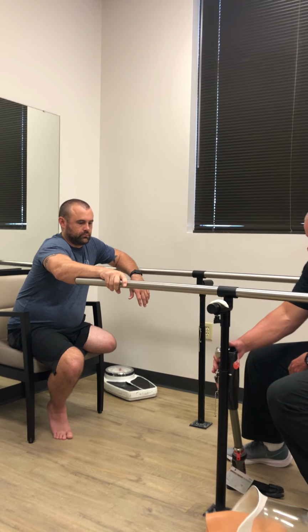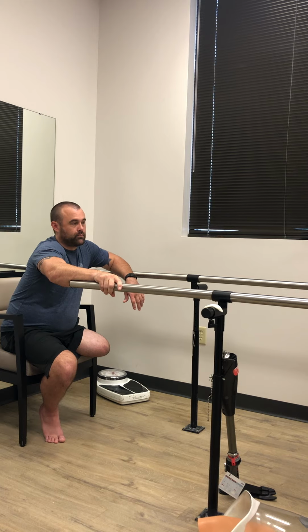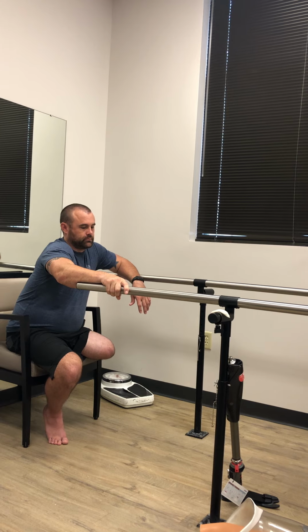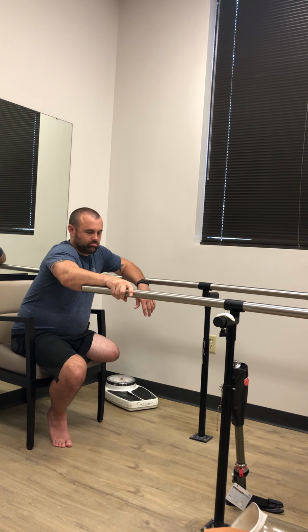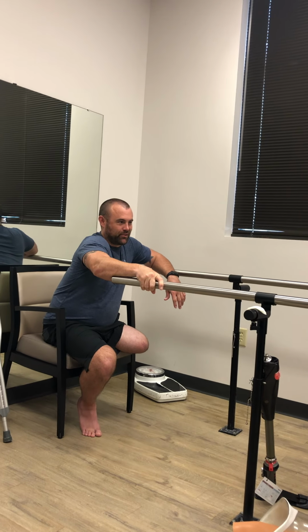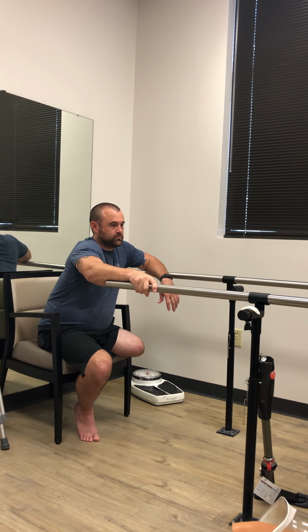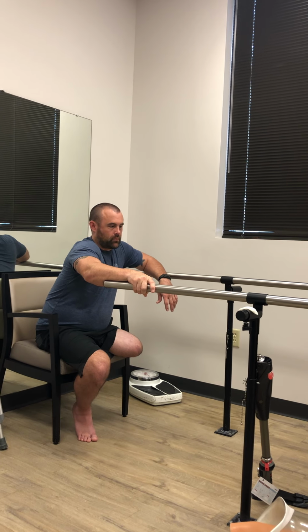So, yes, when it gets fitting badly, can you piston? Absolutely. If you lose a bunch of size and your suction's not holding good, while you're walking, you gotta remember, you're still dragging that around below you. So if your suspension's not good, can you piston? Yeah. For you, I don't think it'll be a big problem. Outside of you being aggressive, I think you'll call me, because you ask a lot of good questions. I think you'll inquire because you'll wanna know. And that for you will be a saving grace, because we'll catch it when it's starting, and hopefully be ready to address it as soon as possible.